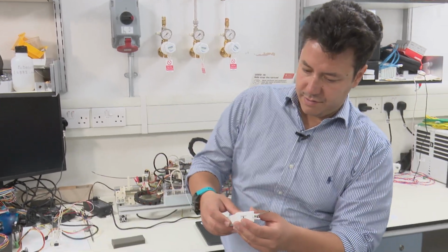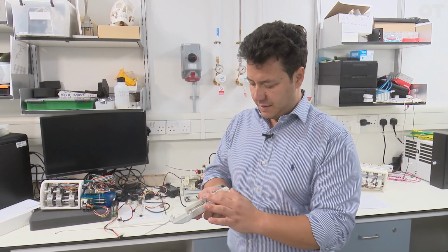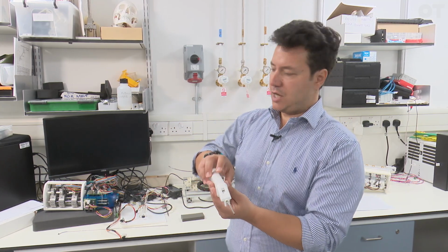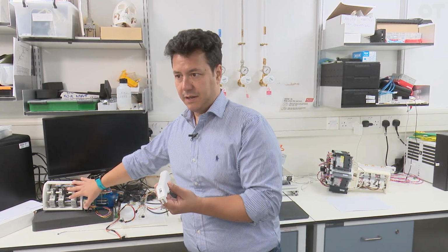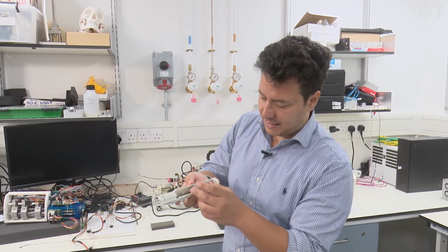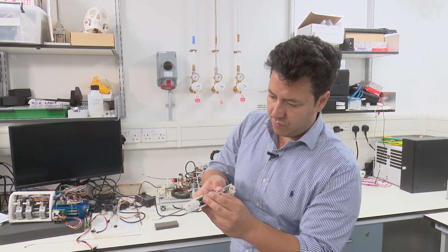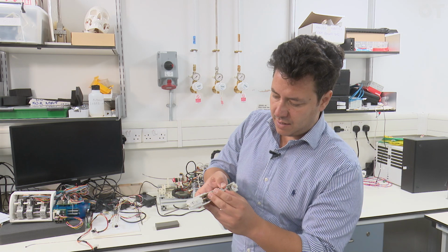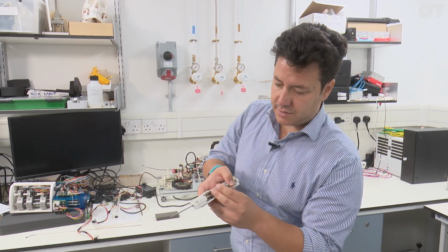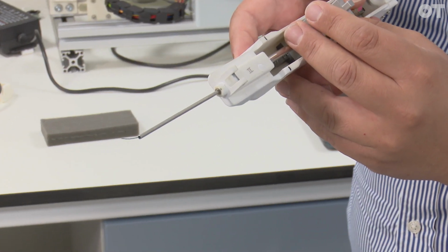So what we have here is the instrument that we are ultimately making. And so this is a geared system that will be deployed on an actuation system, which is what we have here. And inside here we are housing small elements, and depending on how I move these elements in and out, I'm able to control the extension of the tool, and depending on how I rotate them, I can control the curvature of my instrument.